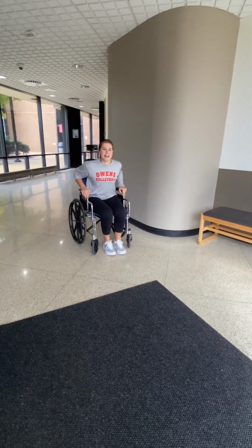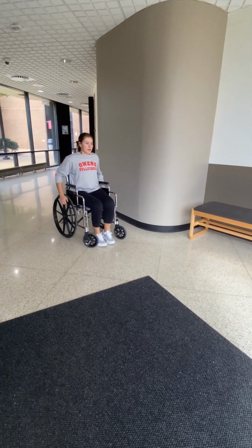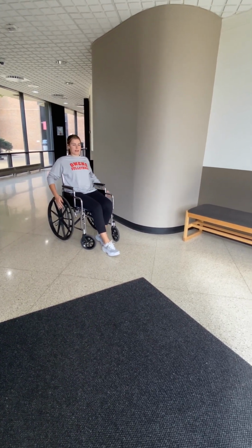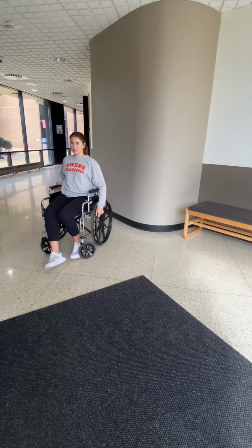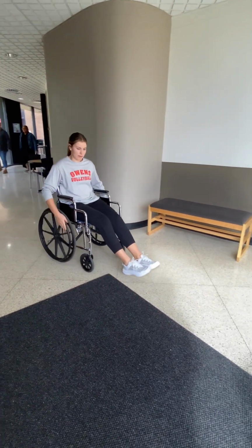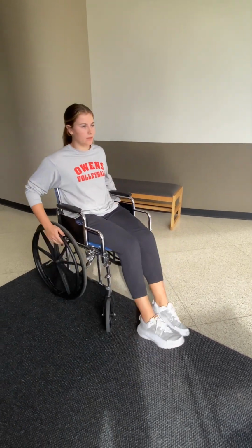Go. And the last one for basic mobility is turning while propelling forward. So what you're going to do is use one hand to kind of resist the tire, and the other hand will be propelling, or turning, depending on what direction you want to go. So if I'm going to turn to the right while I'm propelling, I'm going to use my right hand to kind of resist the rim, and my left hand will be moving the wheel.